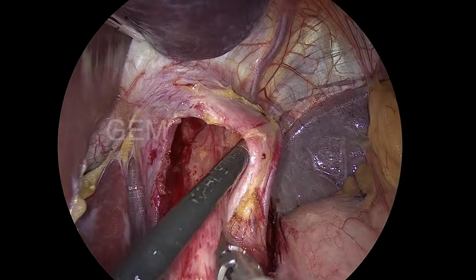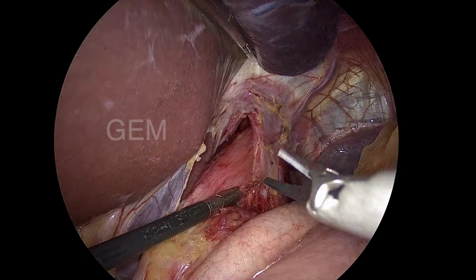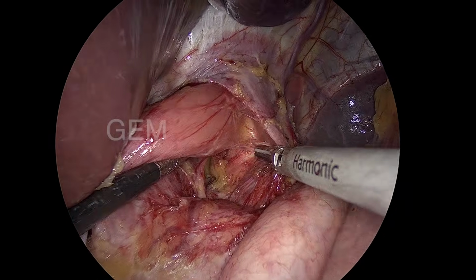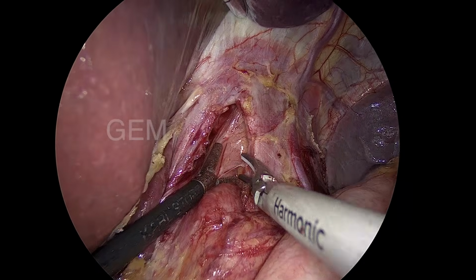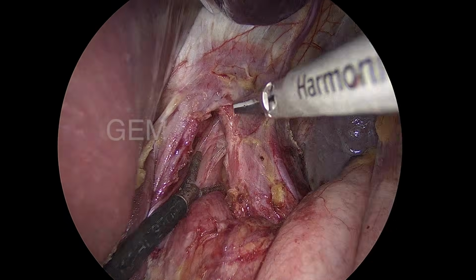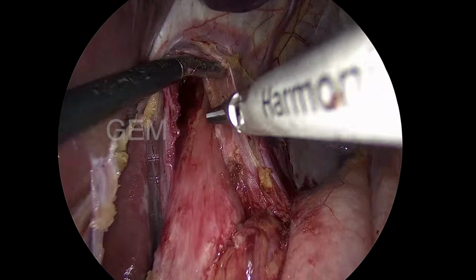So, already I have done the right side, anterior, and then this is the left side I am doing. The left pillar of the right crus is being separated, retracted. Now you can see I push down the esophagus. I cannot hold the esophagus at any time. You can see I open the instrument, I press down the esophagus. So that can be done.